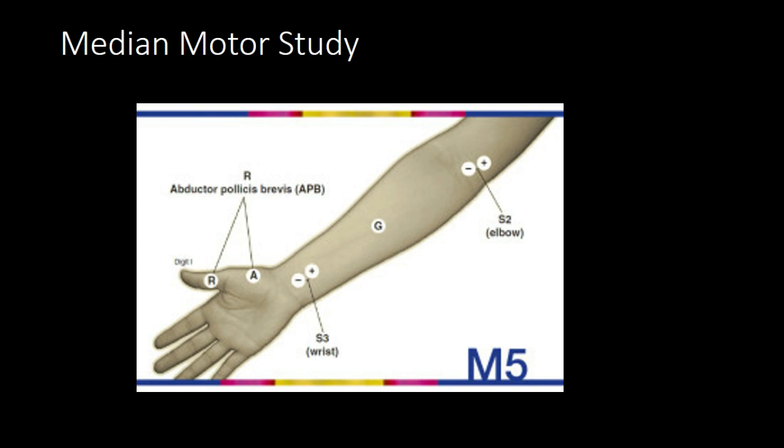And when you're calculating, now see this is such a big patch electrode. So when you're putting that patch over there, do remember to measure the distance from the middle of the patch. That's what I do. If you're measuring from the edge, it will easily make a difference in the conduction velocity and the latency. So be careful. You're going to measure it from the middle, and you try to keep that middle on the dot that you had applied. And sometimes if you are not sure if a patient is having atrophy of the muscle, you can activate the muscle to see where the maximum bulk of the muscle is to get the best study.